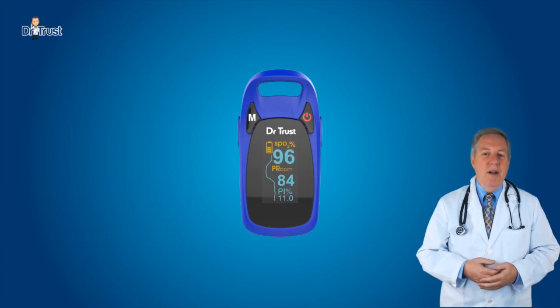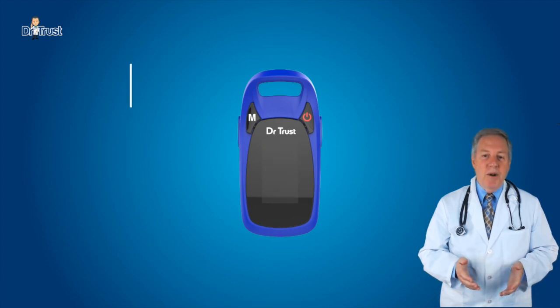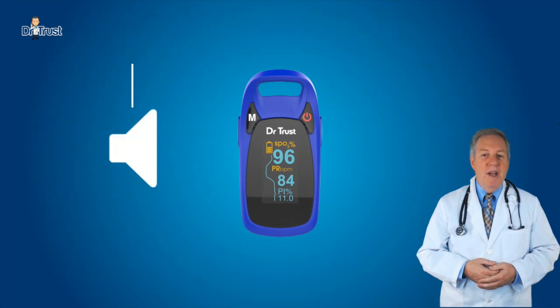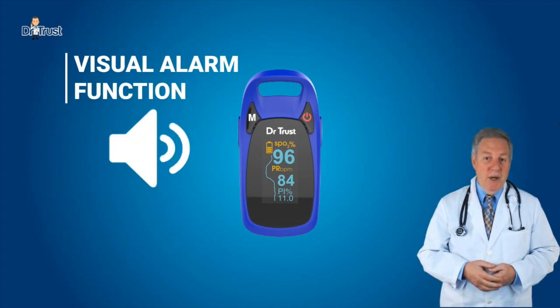The colored OLED display looks brilliant and has simultaneous display for testing value and plethysmogram. The brightness can be adjusted from level 1 to 5. The oximeter can measure low perfusion down to 0.2% and includes a visual alarm function for real time spot checks.